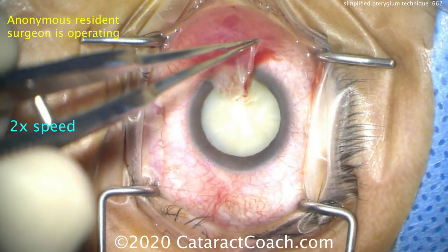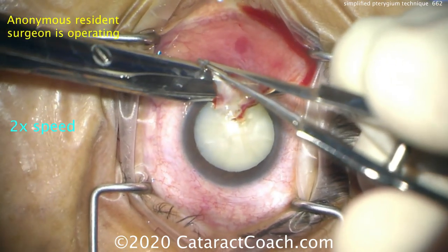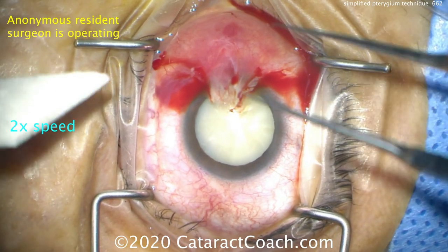Now, placing the Westcott scissors, we want to dissect the tunnel underneath the pterygium. We know it's very adherent to the cornea, so we'll just make a separation there — and that's enough of a tunnel to connect both sides.